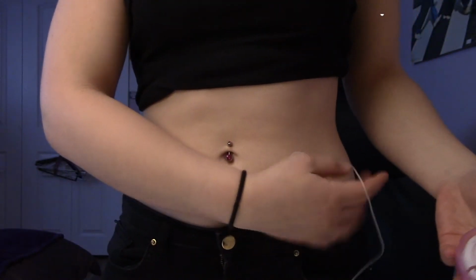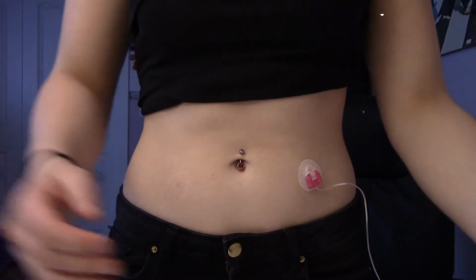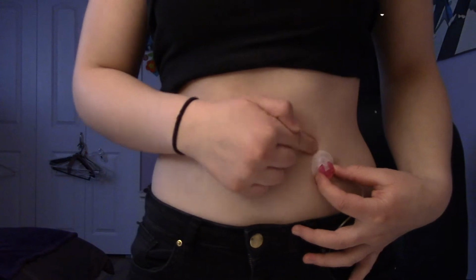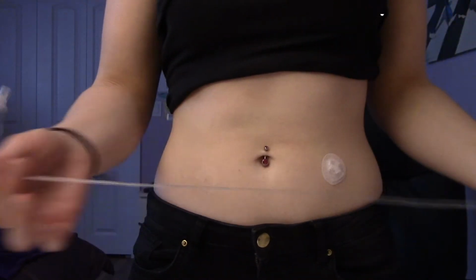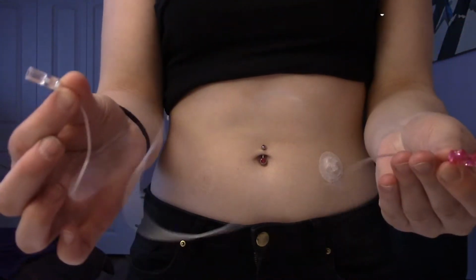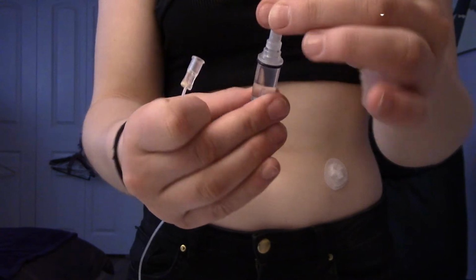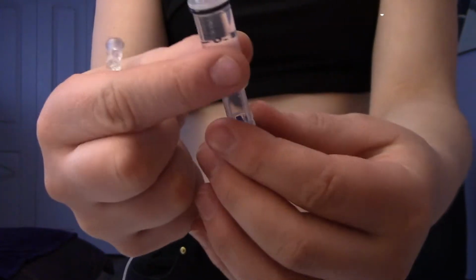Okay, so once this part is done, I'm just going to take the lid, put this back on, and it's ready to go in recycling. The next thing I'm going to be doing is unhooking the pink part from my insertion site. Just like that, all you have to do is pull gently, and then I have my main tubing. I'm going to take my cartridge, pull off the top here. You should see a nice exposed part here. You want to make sure that you're not tipping it, because your insulin will fall out.